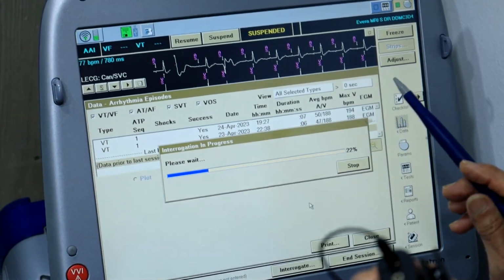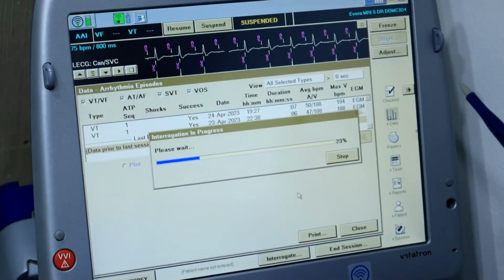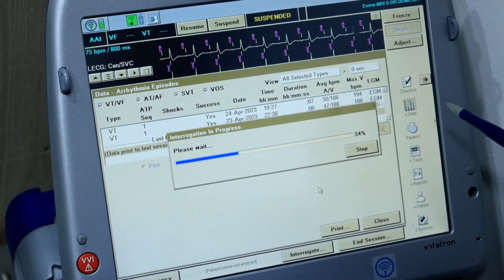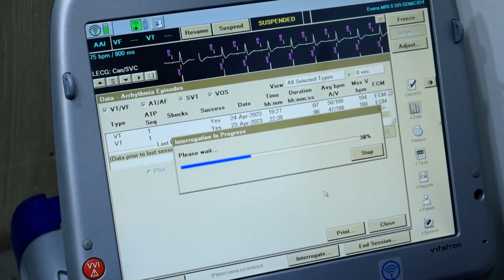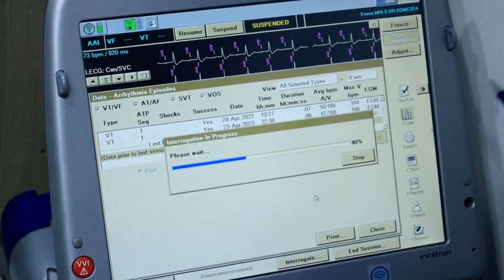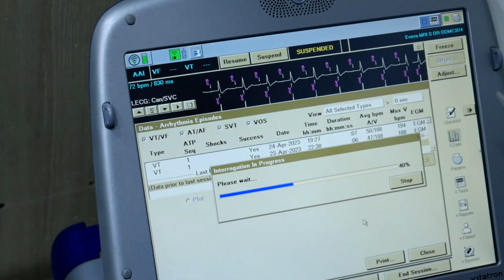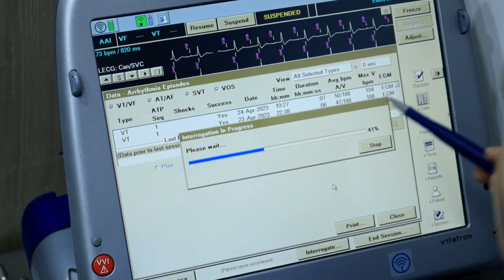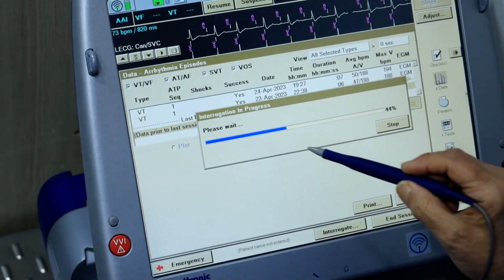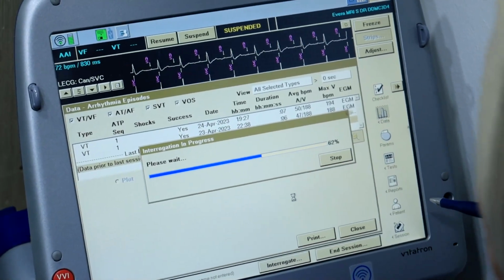He received a dual-chamber ICD, and that's very good because he was atrial paced most of the time from sinus bradycardia, from medication and so forth. He was on amiodarone, Inderal, and anti-ischemic treatment. He's on Plavix, Brilinta and aspirin. We'll continue with his antiplatelet medication, and we'll see. Now we are interrogating the previous episodes.